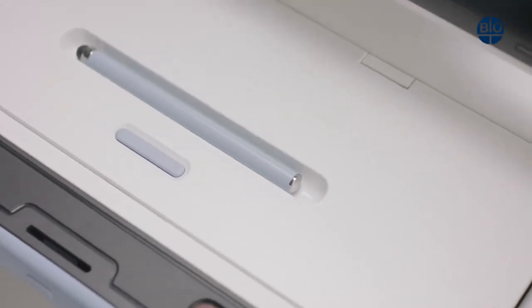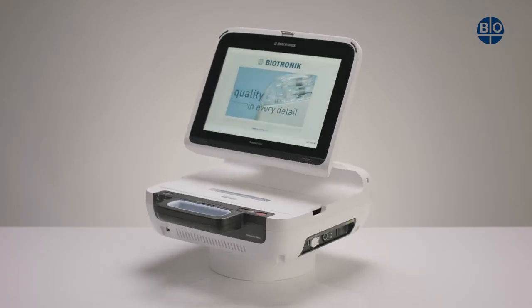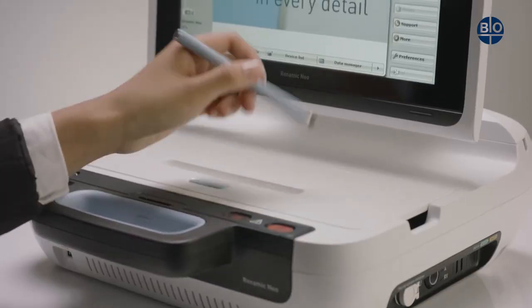The Renamic Neo stylus with soft tip is a key part of the Renamic Neo. It is located here and is easily released from its magnetic holder.